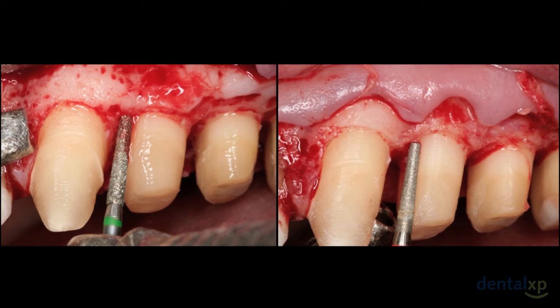Take a good look at the teeth and you'll notice that they're still extremely large. This is not an aggressive procedure. It's a very gentle procedure, keeping the maximum amount of tooth surface possible.